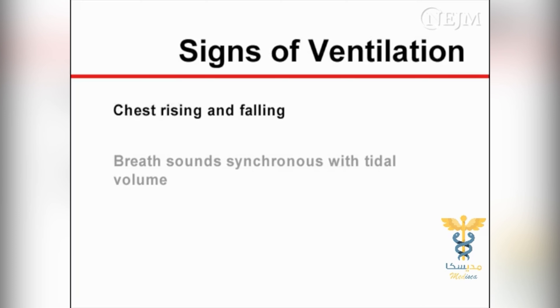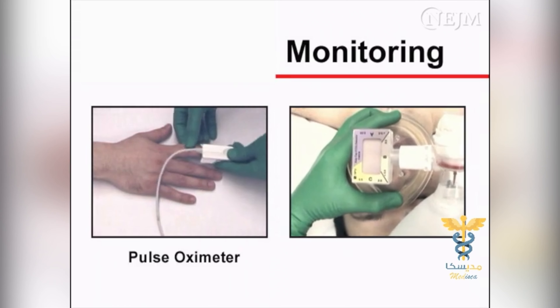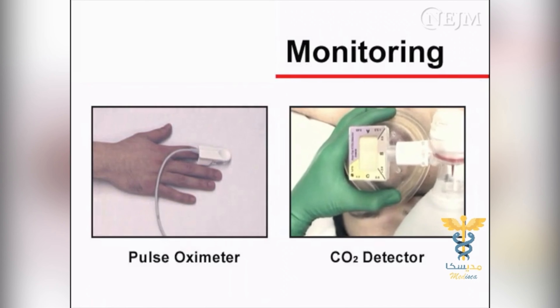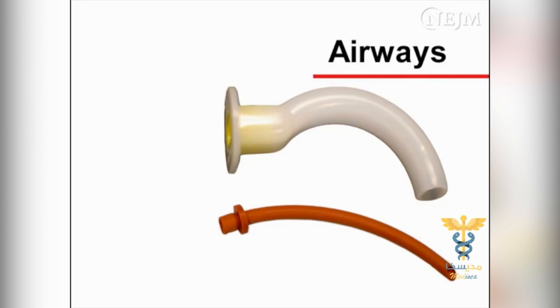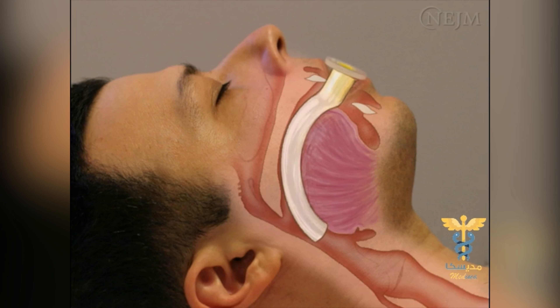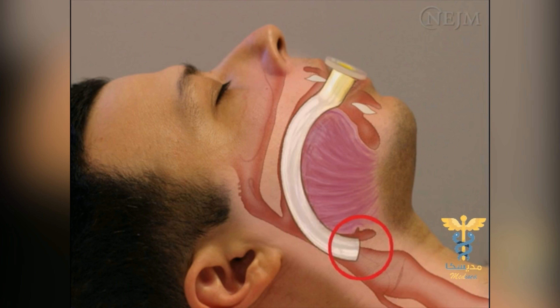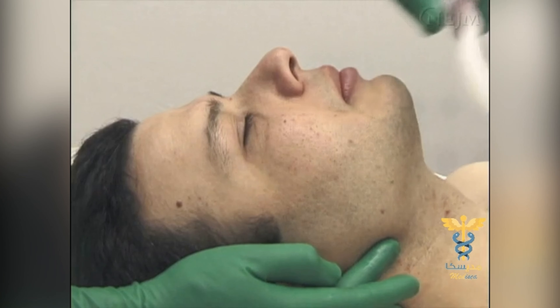One may consider leaving full dentures in place to provide a better mask seal. The most common method to hold the mask consists of placing the thumb and index finger on the body of the mask while the other fingers pull the jaw forward and extend the head. The middle and ring finger are placed on the ridge of the mandible and the fifth finger is placed behind the angle of the mandible. The tongue is the most common cause of airway obstruction. It is important to minimize the pressure applied to the submandibular soft tissues, as this may further obstruct the airway by pushing the tongue against the palate. Maintaining an adequate seal while extending the head, thrusting the jaw forward, and squeezing the bag with the other hand may require considerable manual strength and coordination. Extreme caution is advised in patients with cervical spine injuries in which flexion or extension of the neck is contraindicated. In this situation, the jaw thrust maneuver alone without head extension is recommended.